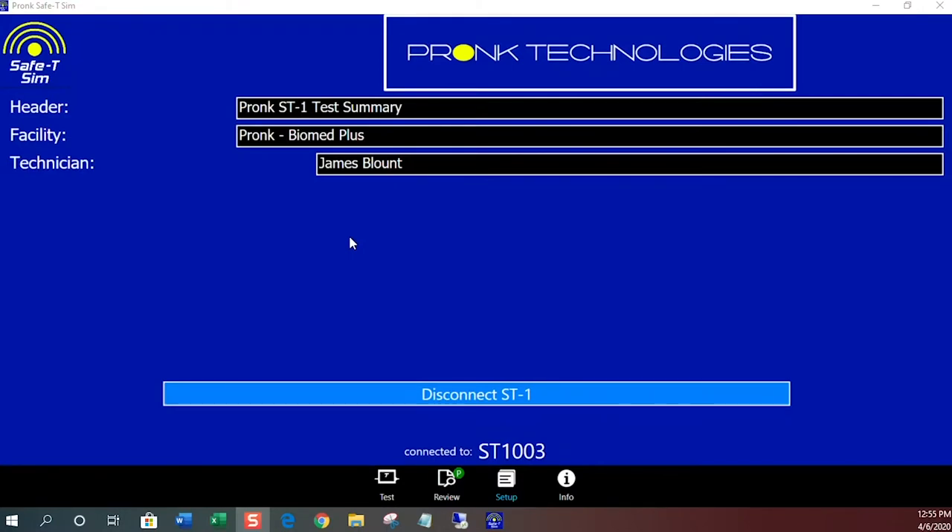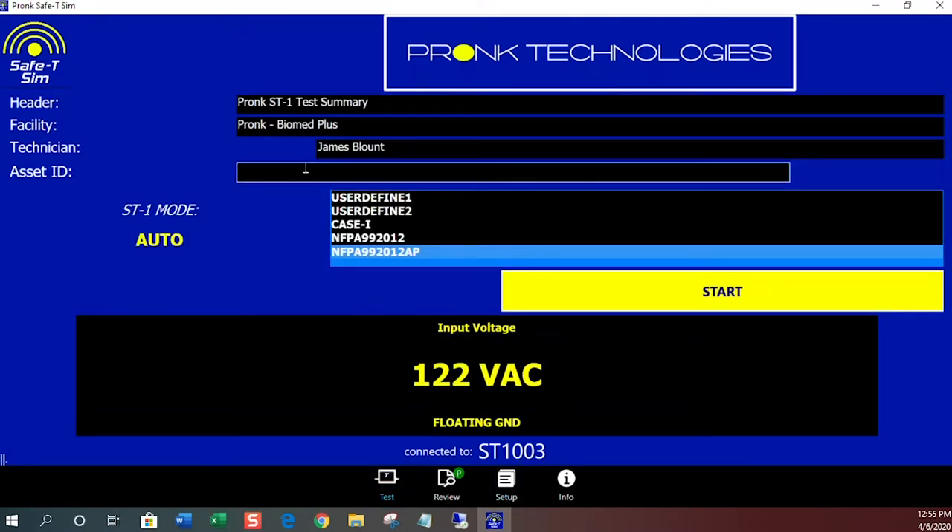Here's the screen capture of the Safety Sim app for a PC. On the setup page you'll enter the facility name and the technician's name, and on the test page is where you'll enter the asset ID or control number and then choose the auto test mode.